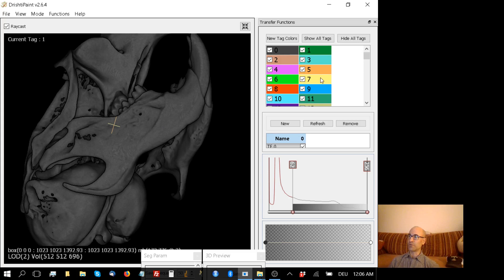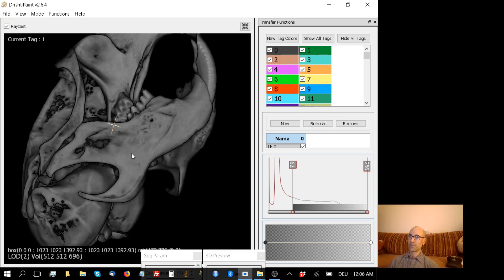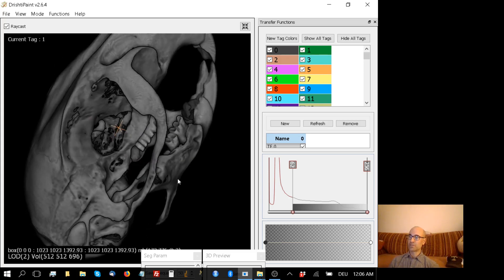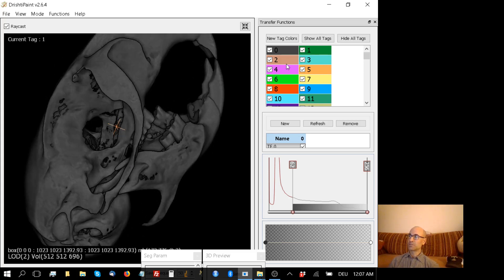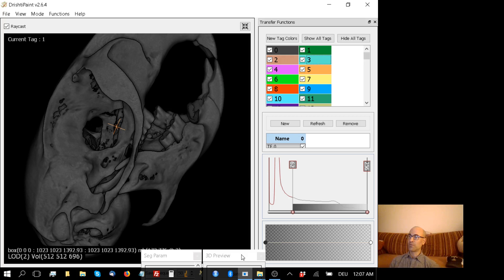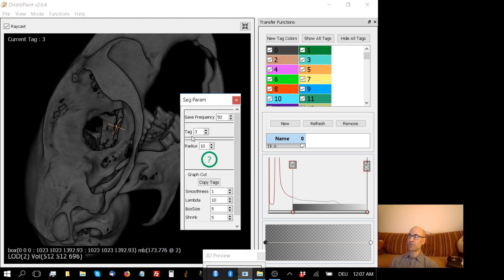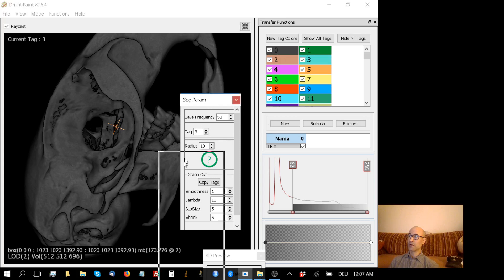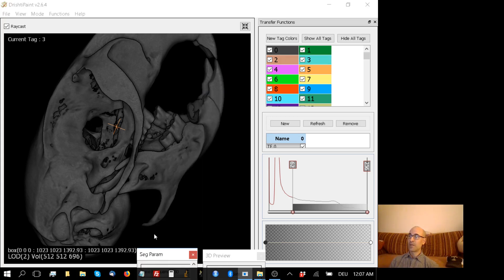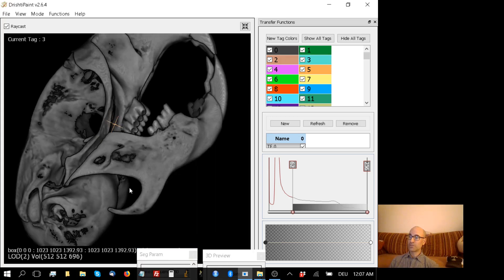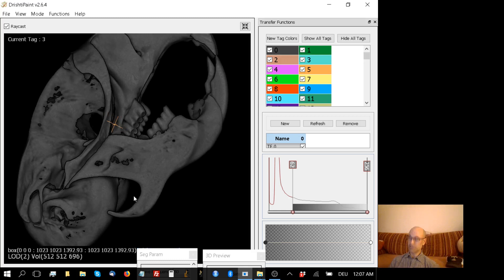These numbered colored swatches here. I want to start by, let's just arbitrarily say that we're going to use tag 3. I'm going to click on 3. When I do that, note that in my segmentation parameter box, tag 3 is selected. I click on 5, changes to 5, 9 to 9, et cetera. So I'm going to go back to 3. Hide my segmentation parameter box. And what I want to do now is tell Drishti Paint that our jaw is going to have this tag 3.